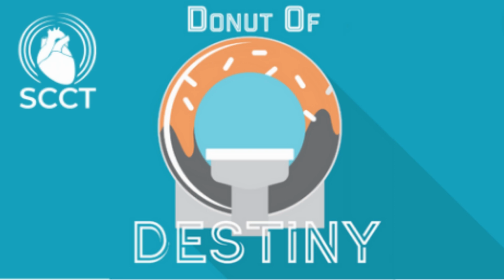I thought, well, maybe there was a way to just derive a very simple anatomic measure to look at the epicardial coronary volume, which we could easily extract from CT, and the myocardial mass, which we could extract also from CT and volume. And perhaps this would provide some insight into these patients without obstructive disease that had positive FFR and maybe ischemic as well. So this was the origin of the concept of volume to mass ratio.